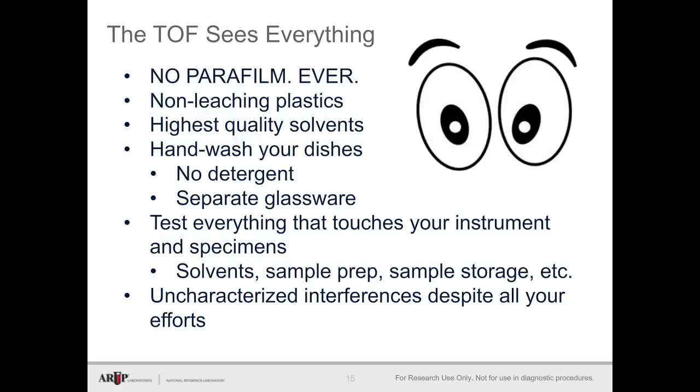So the TOF sees everything. Since you're collecting full scan data, it's going to pick up everything you put into it. So here are a few pearls of wisdom. Being clean and testing everything before you put it into use is paramount and will save you the heartache and pain that comes with troubleshooting.